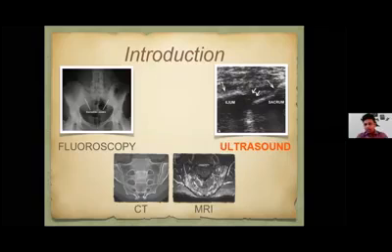So the gold standard for diagnosis is injecting local anesthetic into the joint and looking for the response. If this is positive, then you show that the sacroiliac joint is the pain generator. So that is why it is very important to understand the injections or interventions for the sacroiliac joint, so that you can diagnose the pathology and also treat it.